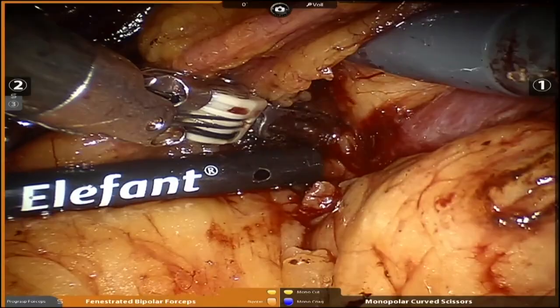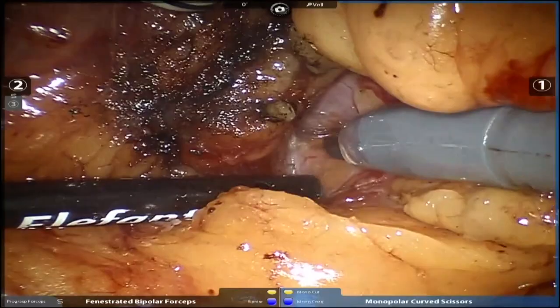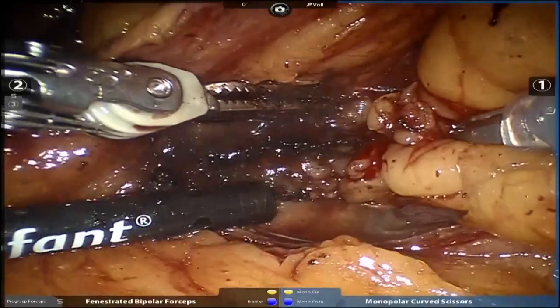Are you going to use the endoscopic ultrasound to mark the tumor on the renal surface? Yeah, I'm a big fan of the ultrasound. We're going to use that very soon because I want to see the depth of the tumor. I also want to plan out my margin of resection. So you routinely use it? Yeah, every case we use it, even the small tumors.